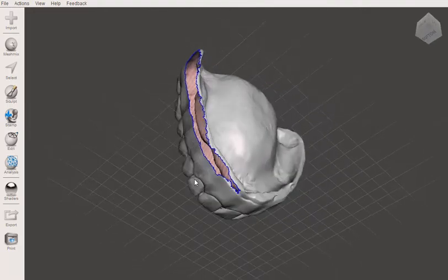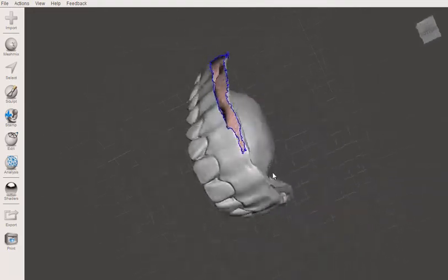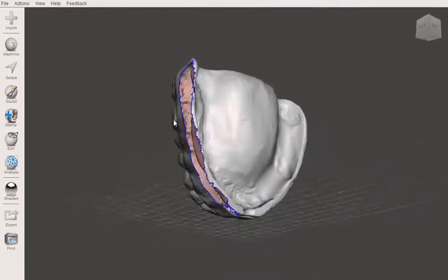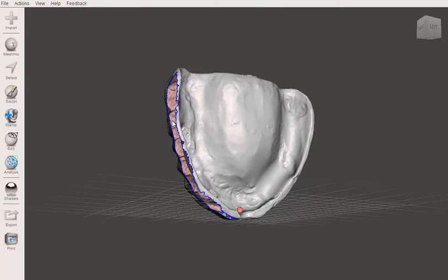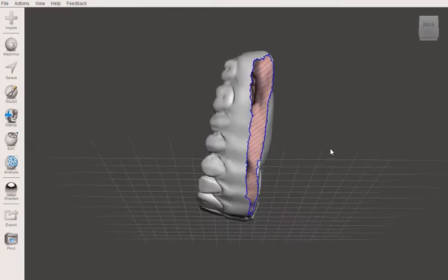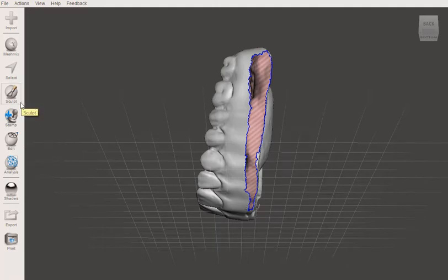But first, before I print duplicates of this, we need to fill this in. So I wanted to show you, this is pretty common when scanning dentures. And so I wanted to show you a cool little way to fix these.